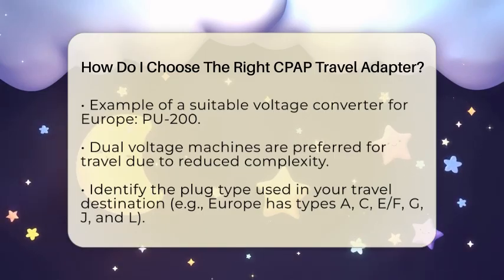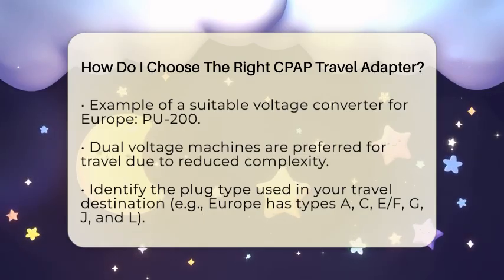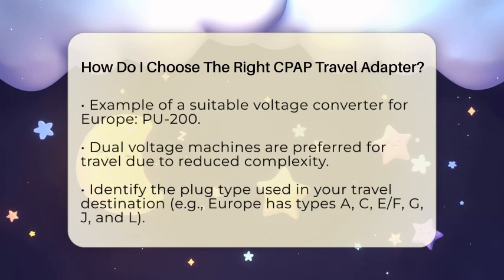having a dual voltage machine is the better choice for travel. Next, you will want to identify the plug type used in the country you are visiting. Different countries have various outlet shapes and prong configurations. For example, Europe uses several types such as A, C, E, F, G, J, and L, while the United States typically uses a two-prong plug.